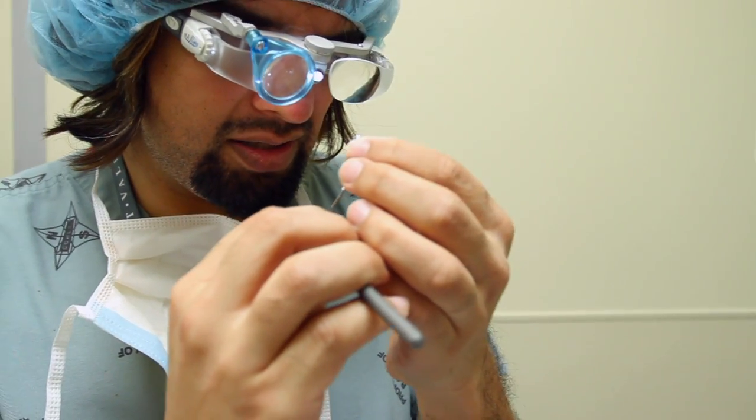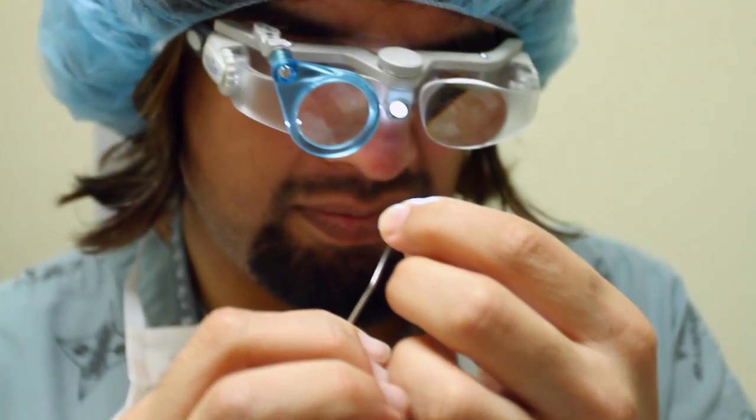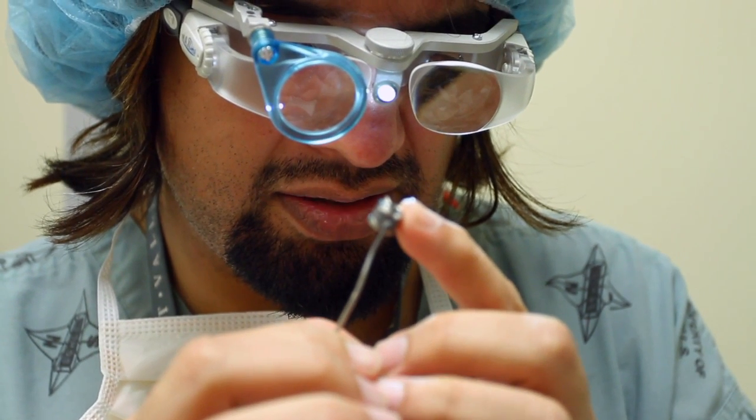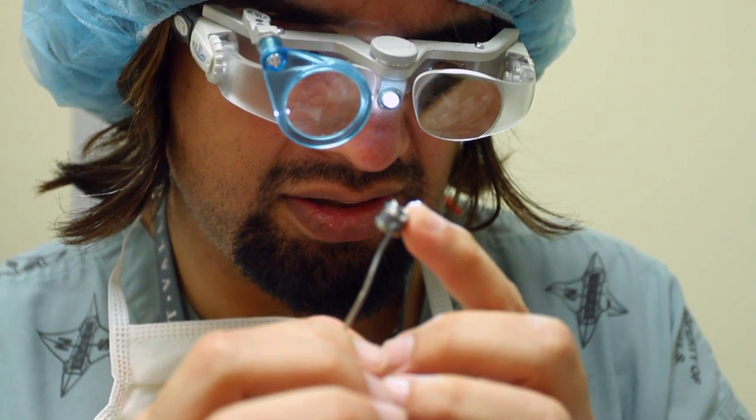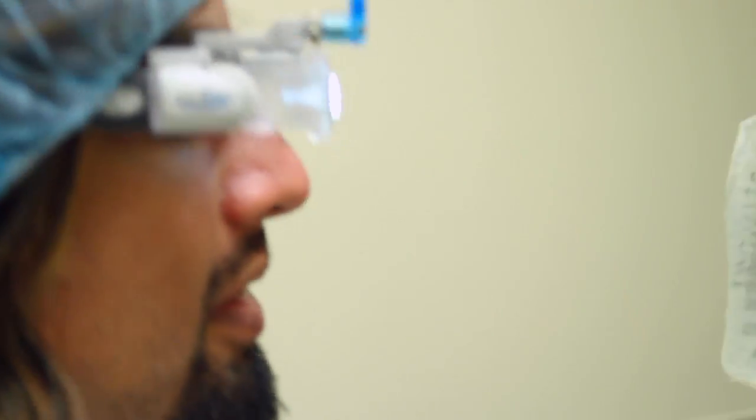Looking through my little magnifying lens, I'm setting the marker to my steep axis here. I can then move the magnifying lens out.